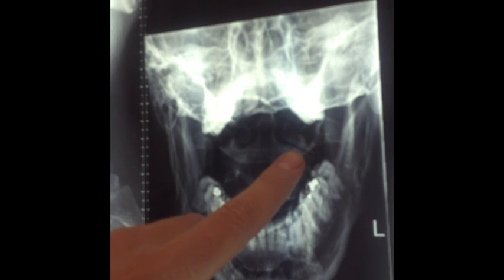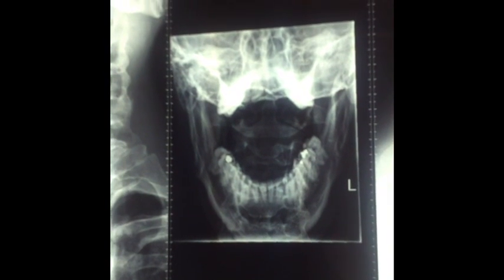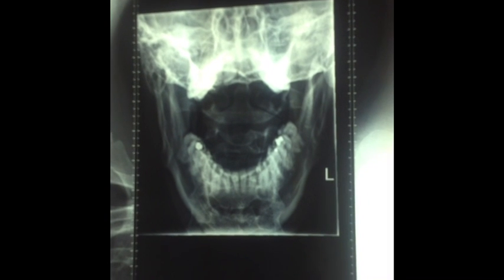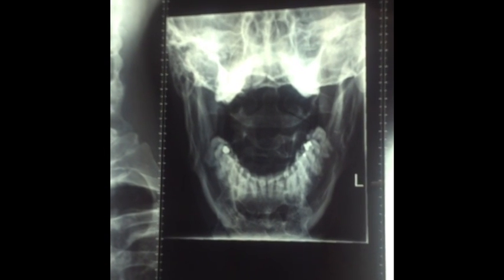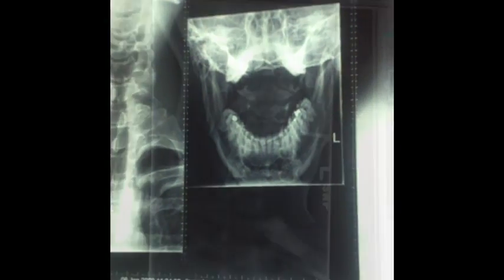For the odontoid, we want to see the lateral masses — that's the main thing. Make sure the distance between C1 and C2 is open. We want to see the superimposed teeth over the back of the base of the skull, make sure the mouth is open nice and wide with no tongue, and the mandibular rami equidistant from the dens.